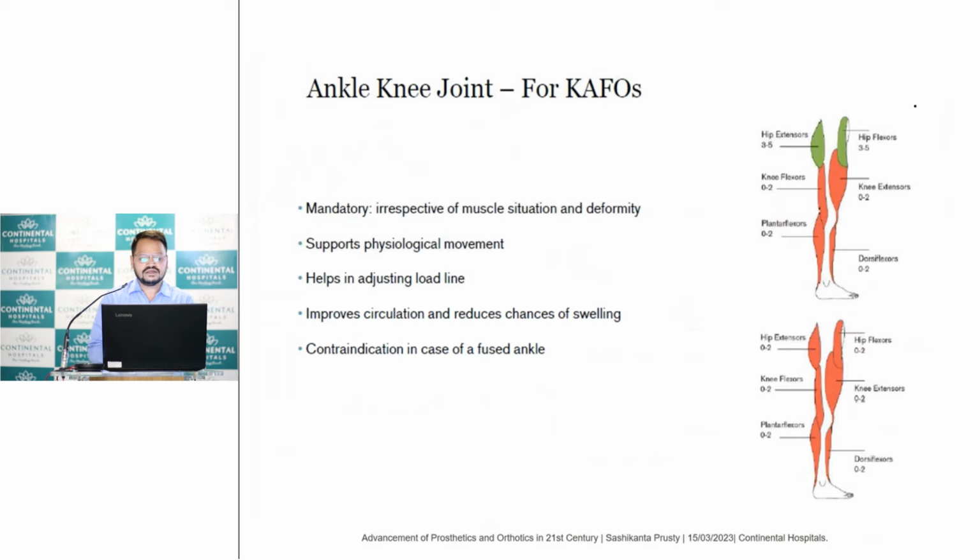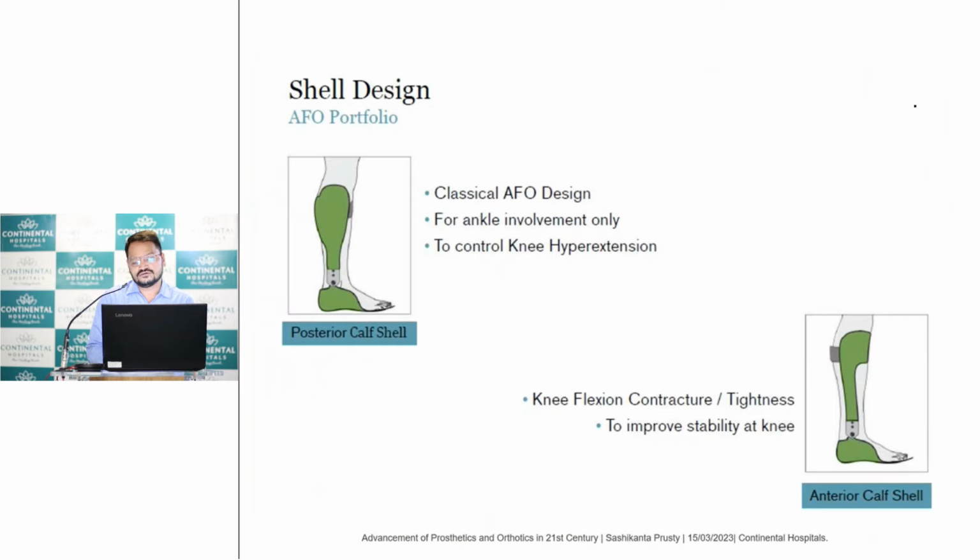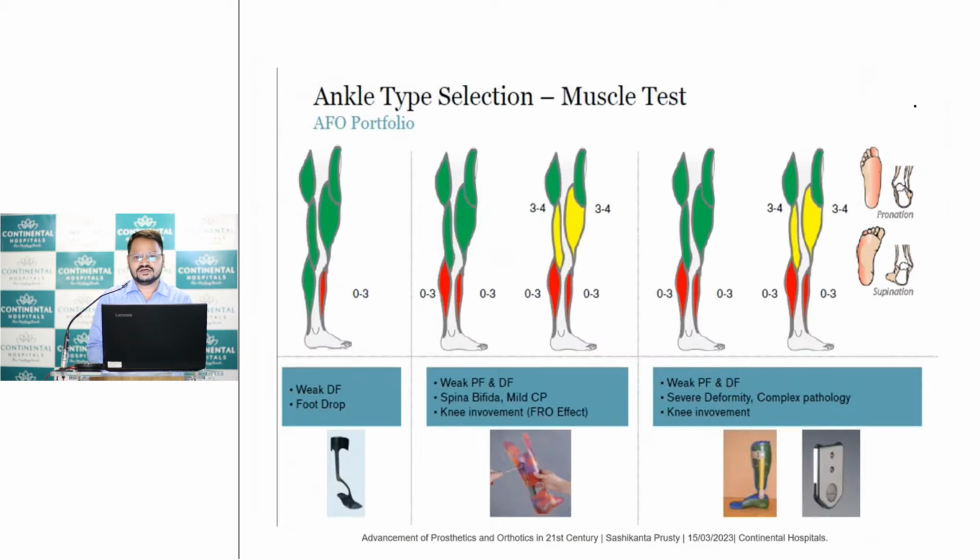Now coming to the AFO, in the same way as we have discussed, this particular design is used when the deformity is around the ankle and foot, and not at the knee or higher levels. We can cover only below the knee area and give the support system. In the same way that we analyzed above-knee conditions like the caliper, with a KFO design or HKFO design, we do it for the AFO design also. So this is how the deformity happens, what the muscle power is, what the correction force should be, what kind of implant we use, and how it controls.